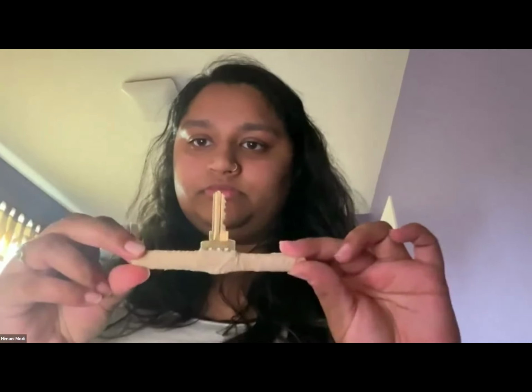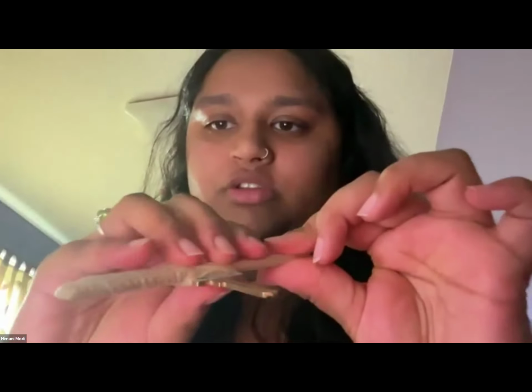So when wrapping it around this, it easily, no tape involved, just quickly wrap it over. And then it also has this, like, it's not stitching, but I don't know what to call it. I guess it is stitching, but it has texture to it. So that way, when you're handling it, it's giving you some more gripping. Once you put it all together, you end up with something like this, where the Coban has that texture, and you can definitely fit all your fingers on it.